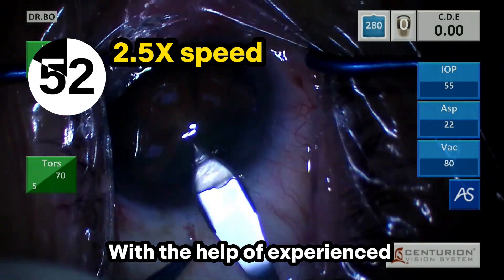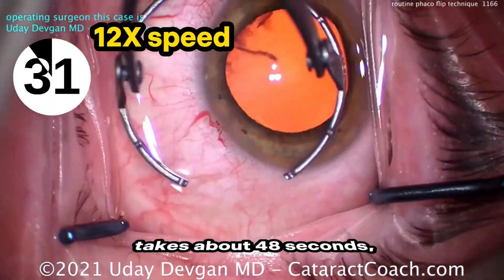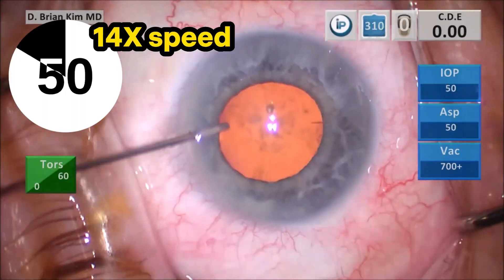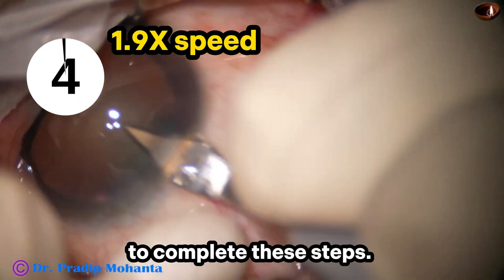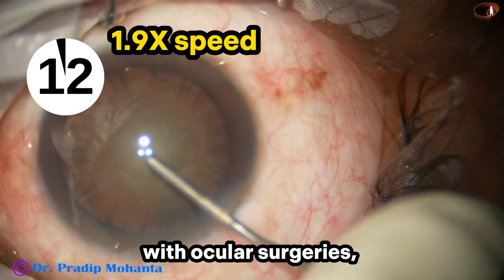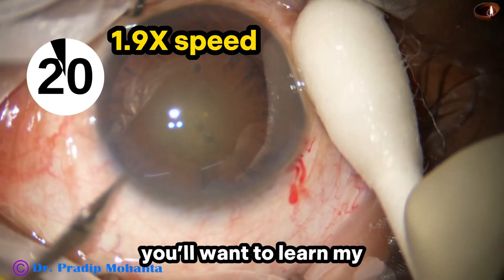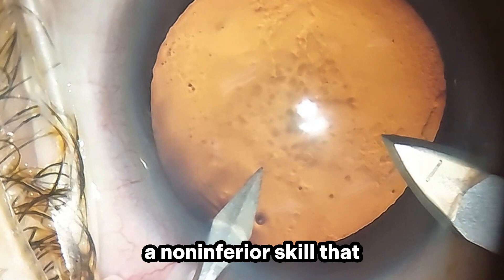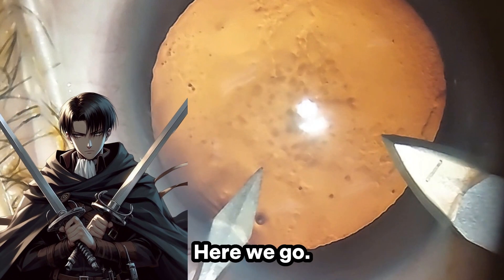With the help of experienced scrub technicians, experienced surgeons like Professor Uday Defkin take about 48 seconds, Dr. Brian Kim takes about 1 minute and 13 seconds, and Dr. Pradeep Mohanta takes about 24 seconds to complete these steps. Personally, I don't have scrub techs who are familiar with ocular surgeries, so I handle my instruments all by myself. If you're like me, you'll want to learn my dual blade viscocelle technique, a non-inferior skill that takes less than 30 seconds on average without sacrificing any safety.